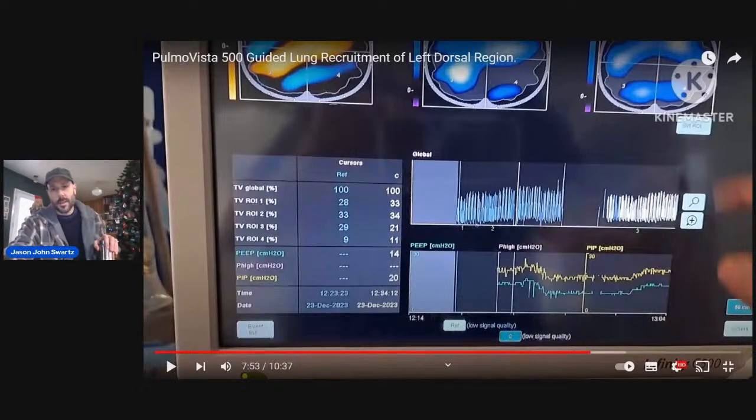You can have over distension of the lung when it's atelectatic, so it's all closed up, and then the good alveoli are the ones that are getting over distension with the additional tidal volume. Also, on expiration, alveoli that are collapsed will tug on the adjacent alveoli. So you'll actually get possible volume trauma because it's dealing with way more volume because you're at 30% capacity. So you get volume trauma there.